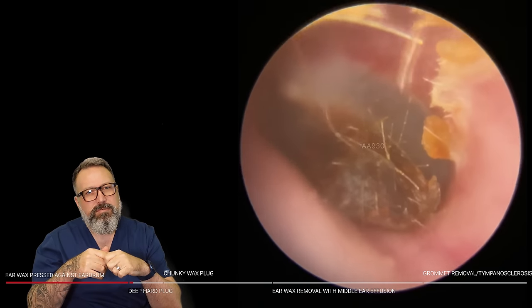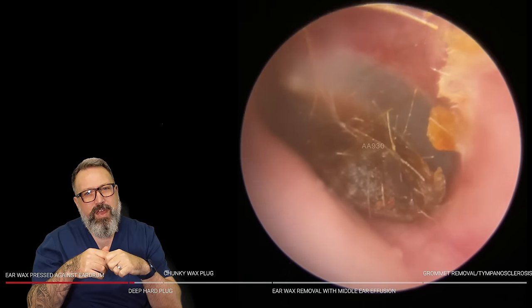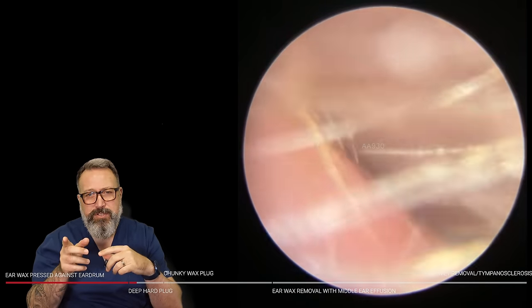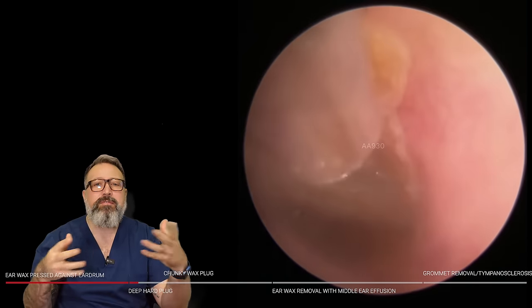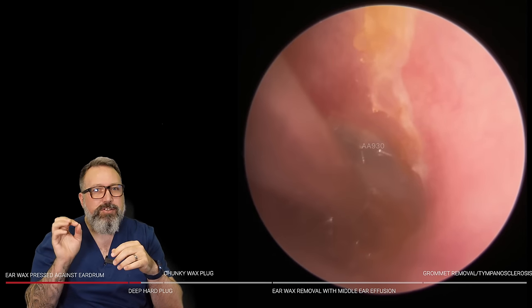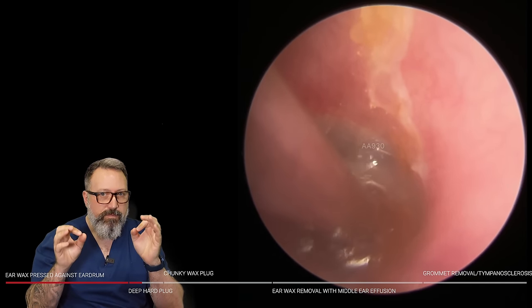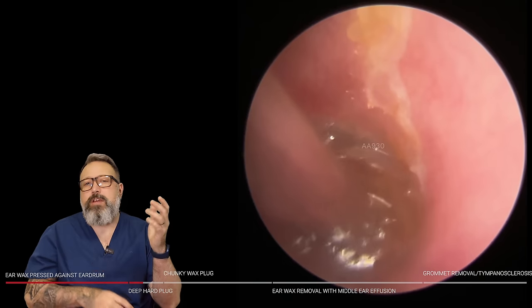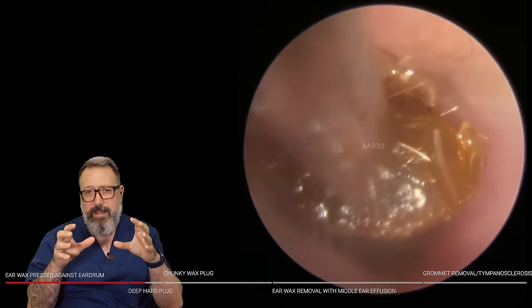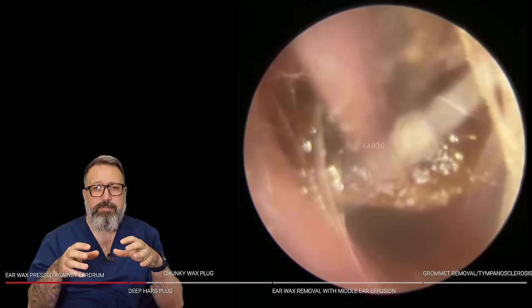We've got a very, very deep plug here — this is a second patient in the compilation. The previous one, everything got sucked inside the suction tube, so I left that one out since you guys don't like tank shots. This patient has a very, very deep piece of wax sitting right up against the eardrum — it's been pushed down in place with a Q-tip again.